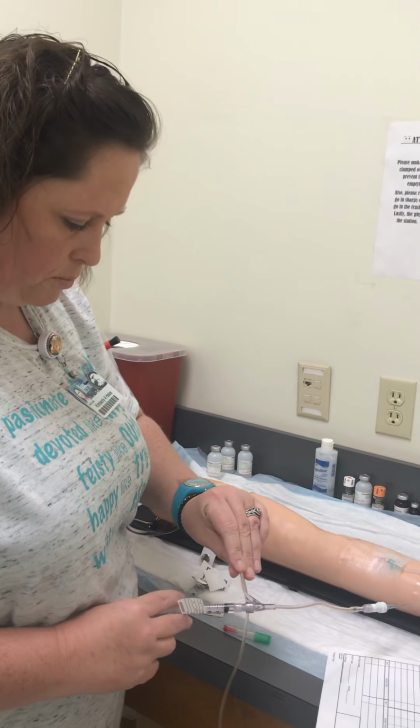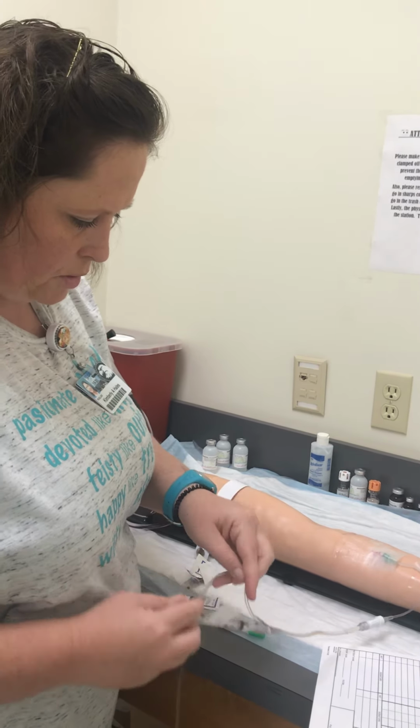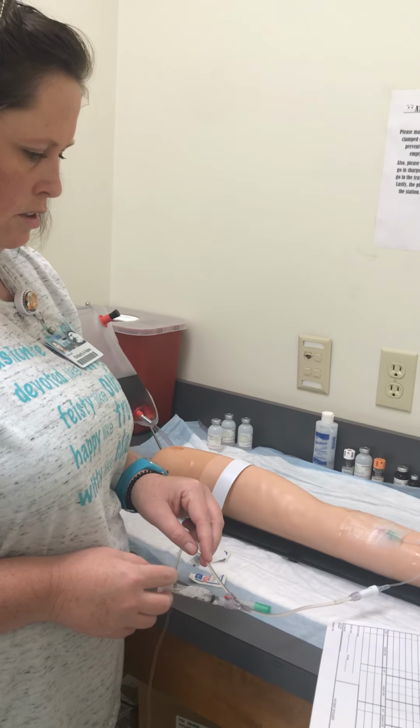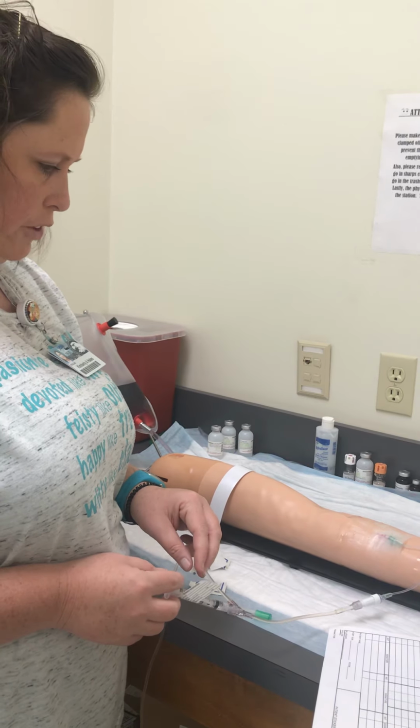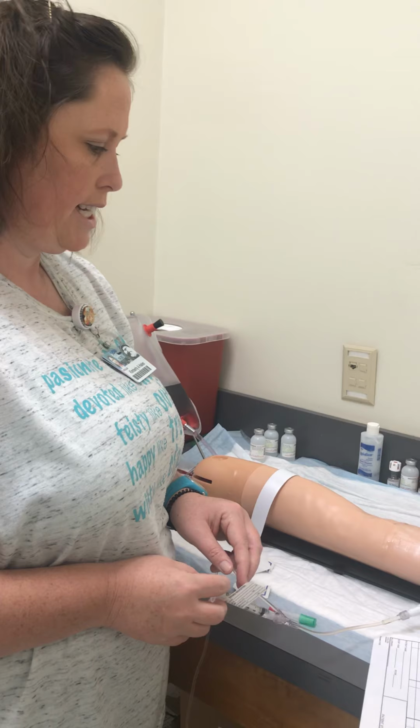And give another one. I'm going to monitor it before I let it run for 1 full minute. Still monitoring for signs and symptoms and any reactions. He's not having any.